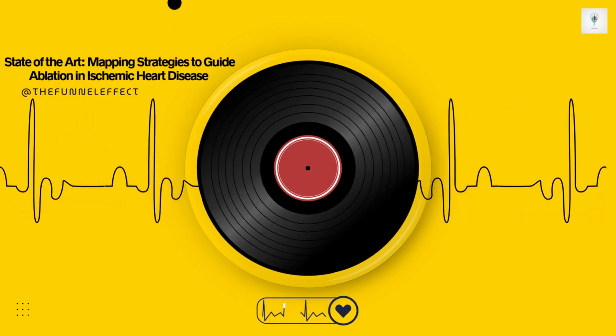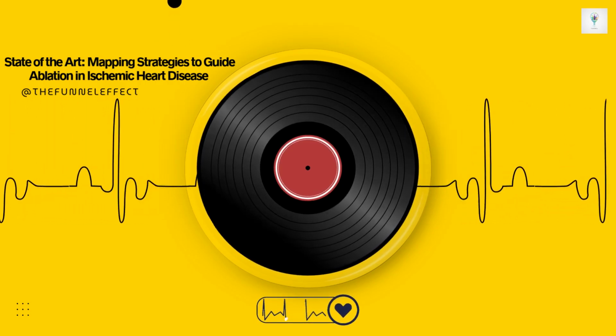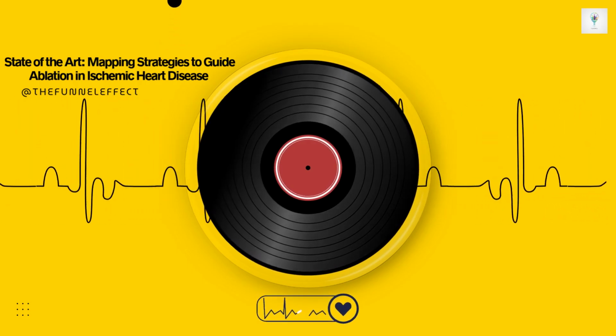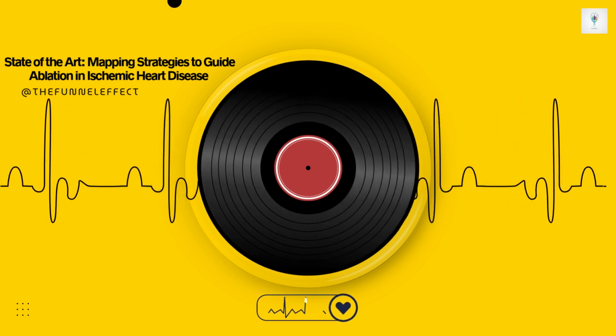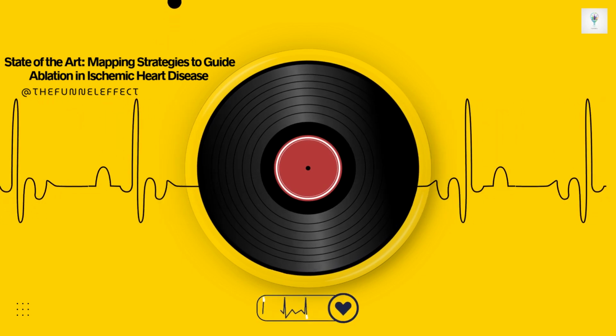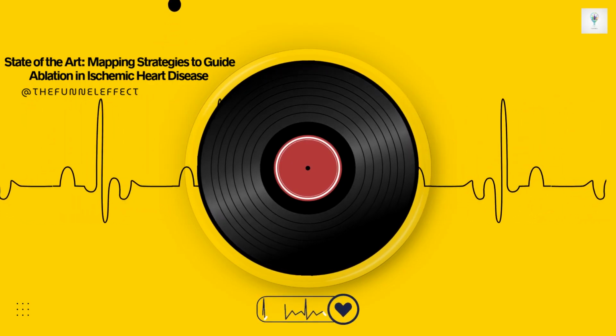Right. The persistent elephant in the room, as the review highlights repeatedly, is the intramural substrate. We know that many, maybe even most of these critical VT isthmuses are not right on the surface. They're buried deep inside the heart wall. And we also know they can connect to the endocardial or epicardial surface at very discrete points, making them look deceptively simple, like a focal source, when mapped from the surface.